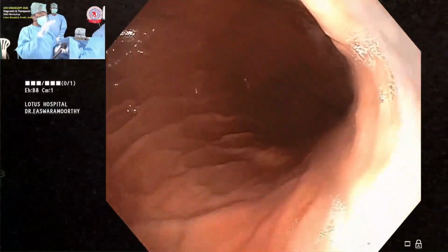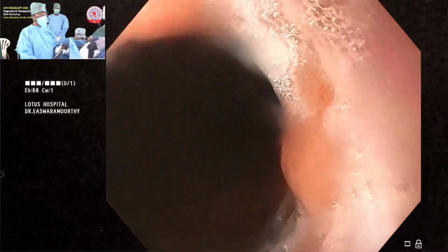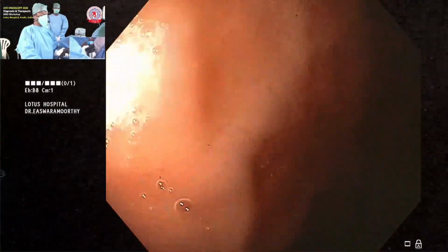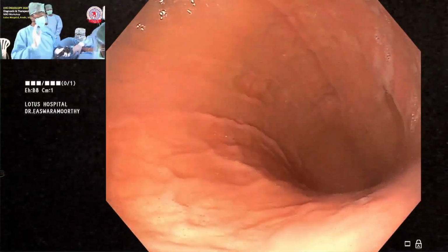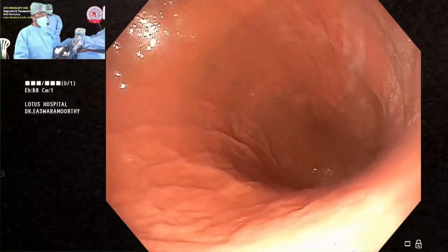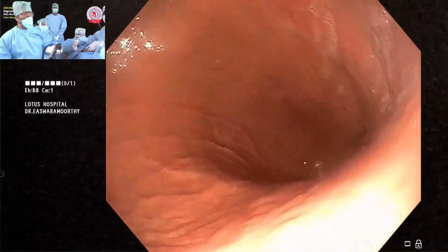As you can see down further in the darkness, you see the antrum taking a right turn towards 3 o'clock. So what you should not do is go towards 9 o'clock. If you go to 9 o'clock, then you will be entering and spending all the time getting lost in the roomy stomach, which is a problem for the beginner. How to avoid that? I am going to tell you 3 things, repeat for your life. What are the 3 things?